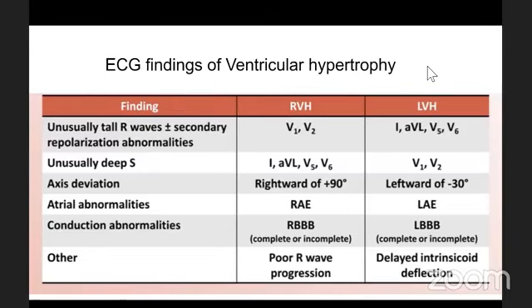Sir, many times we see patients with LVH or HCM having the pattern of short PR interval. Can we straightaway say it's due to an accessory pathway, or is it inherent to HCM?